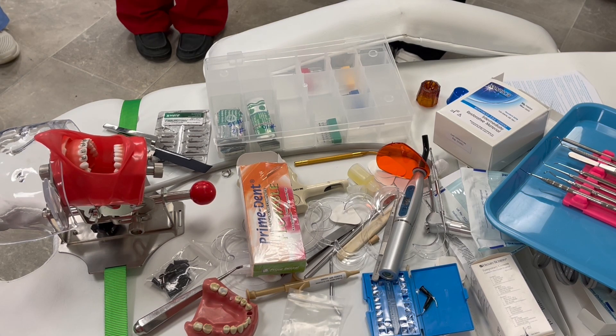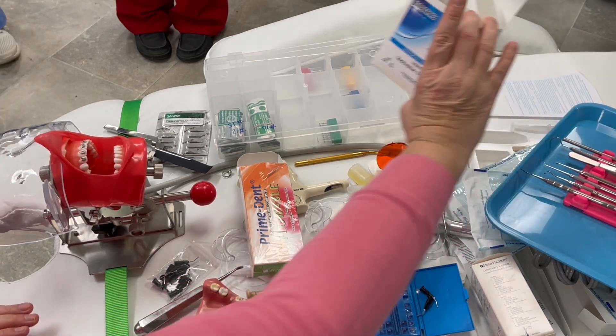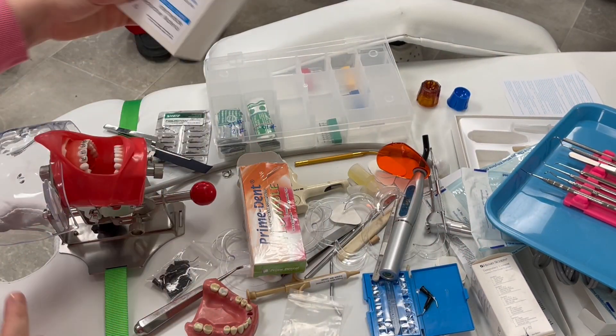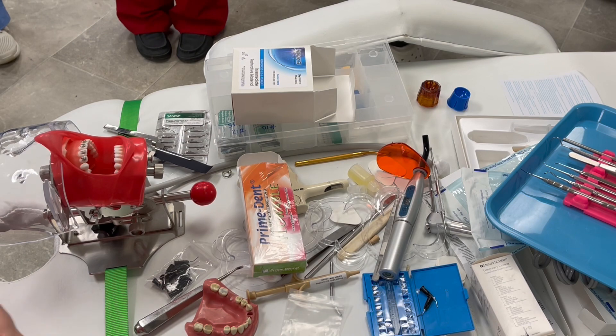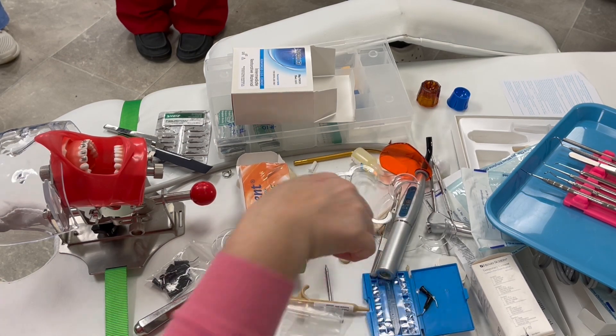We also have intermediate restorative material — that's the stuff you use a spatula with. That's something you would do chair side. We're going to switch gears a little bit and go look at some of these instruments.